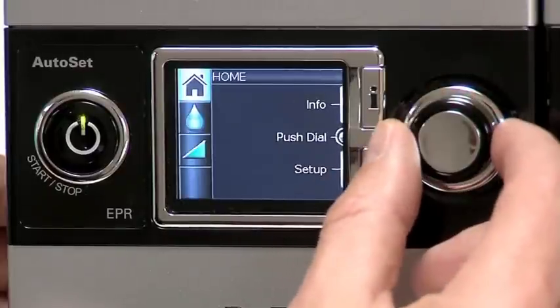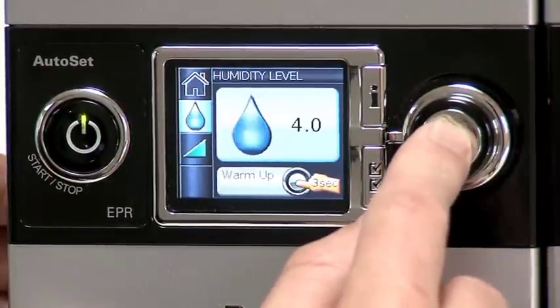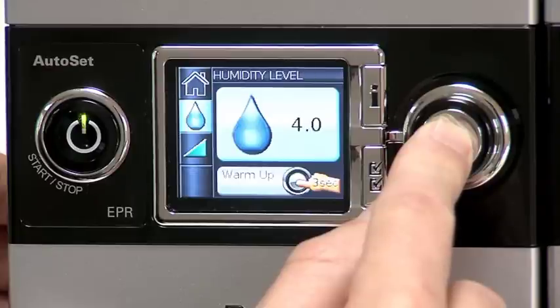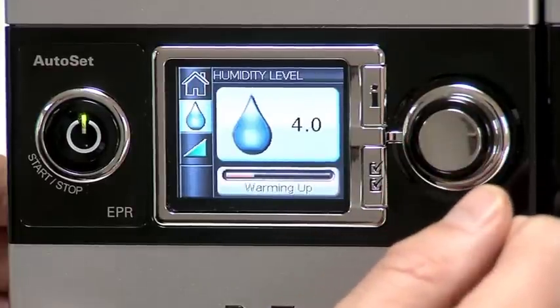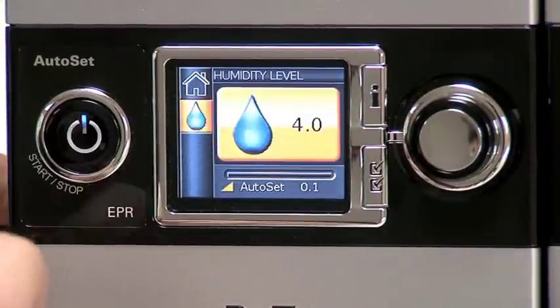Preheat the water before you start treatment. To start warming, navigate to the humidity level icon and push and hold the push dial for 3 seconds. The warming up status bar will be displayed. You can stop warm up at any time by pressing the push dial for at least 3 seconds. You can start treatment at any time by pressing the start/stop button.